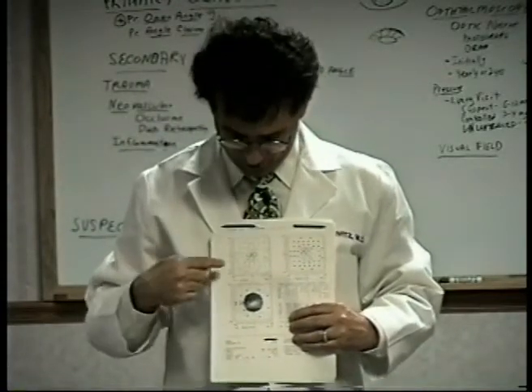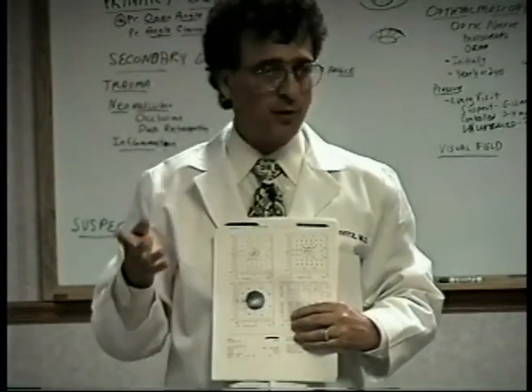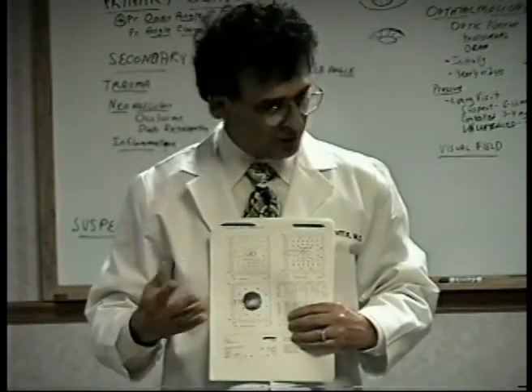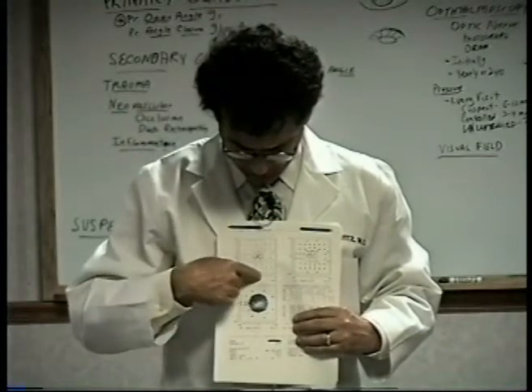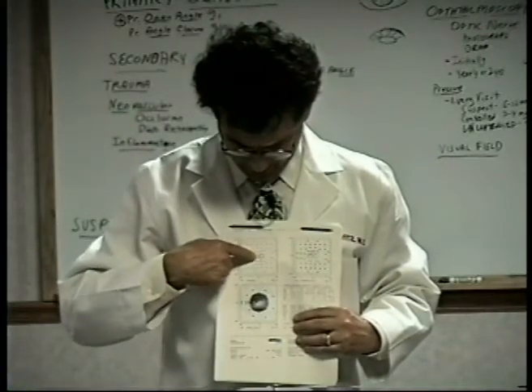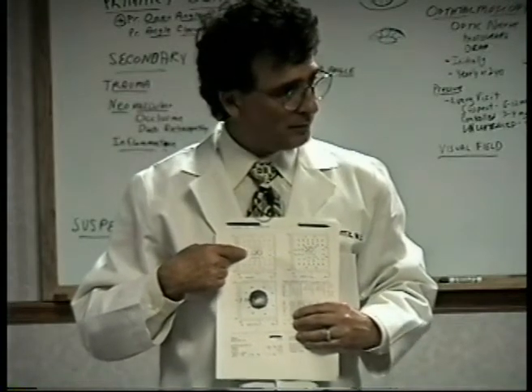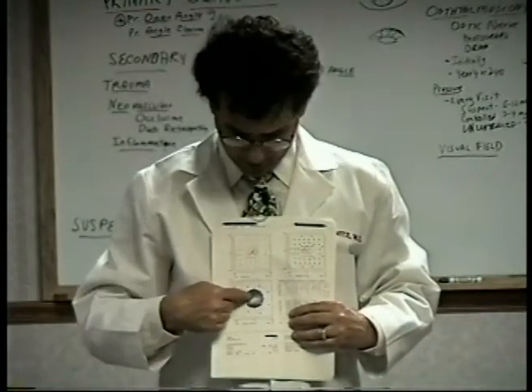Now, isn't it nice that these field machines will find the damage before he can? And actually, look how bad it is. It's pretty bad, but he can still see to get around. There are a lot of zeros out here. But right in the center, you've got 20s, 29 in the middle. These might have 20/20 vision. Okay? But that's pretty obviously wrong.